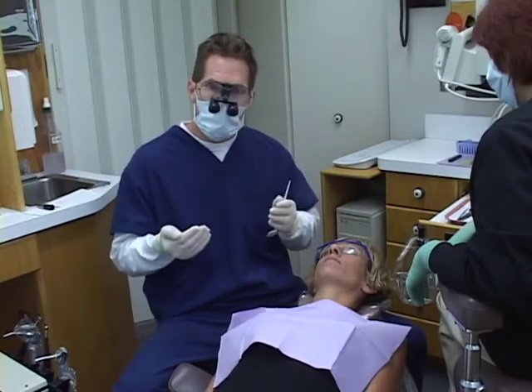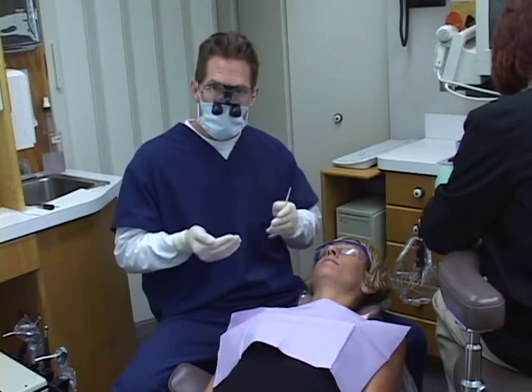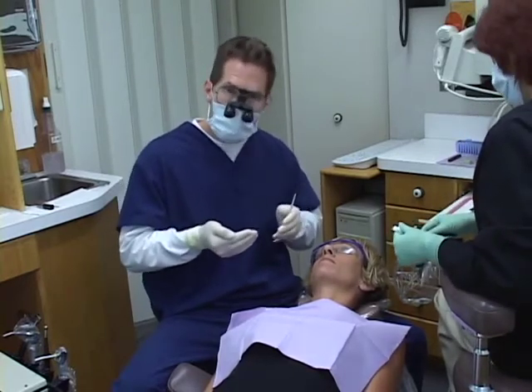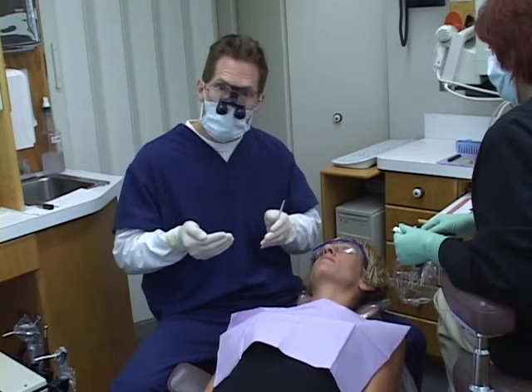Secondly, after those have been refined, we will then go in and eliminate all posterior working, balancing, and protrusive interferences. And then finally, we will refine the anterior guidance and make sure that the anterior guidance is in harmony with the envelope of function. And we will do them sequentially in that order.